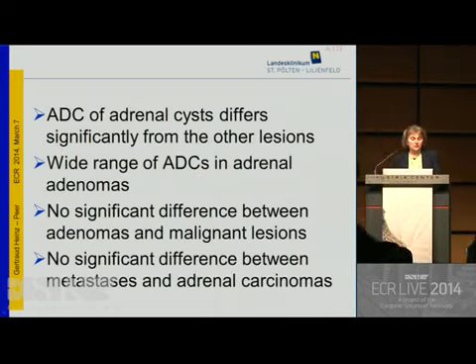The ADC values of adrenal cysts differ significantly, but otherwise there is a wide range of ADCs in adrenal adenomas. And there is no significant difference between adenomas and malignant lesions. There is also no significant difference between metastases and adrenal carcinomas.